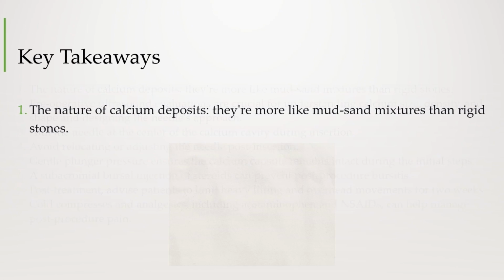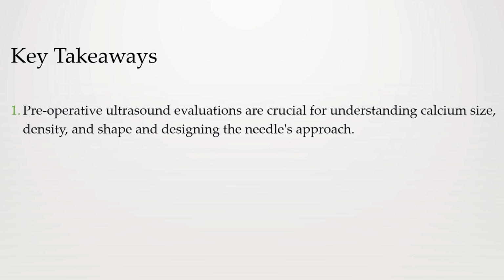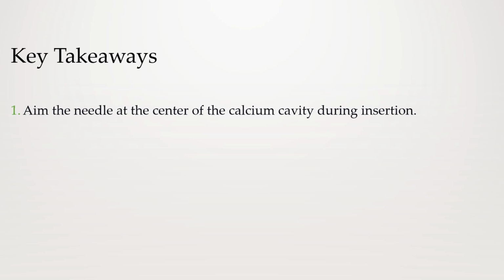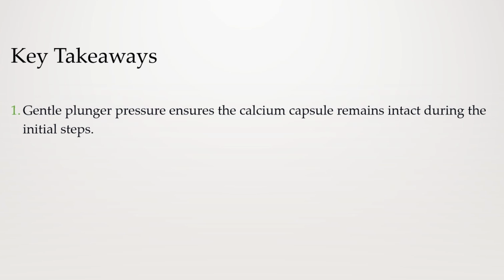Key takeaways. The nature of calcium deposits: they're more like mud-sand mixtures than rigid stones. Pre-operative ultrasound evaluations are crucial for understanding calcium size, density, shape and designing the needle's approach. Aim the needle at the center of the calcium cavity during insertion. Avoid relocating or adjusting the needle post-insertion. Gentle plunger pressure ensures the calcium capsule remains intact during the initial steps.